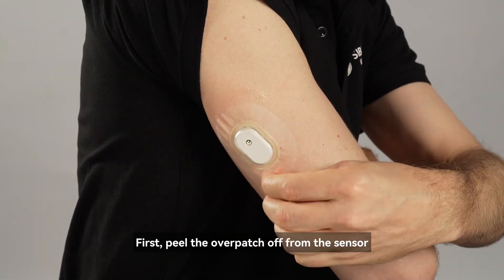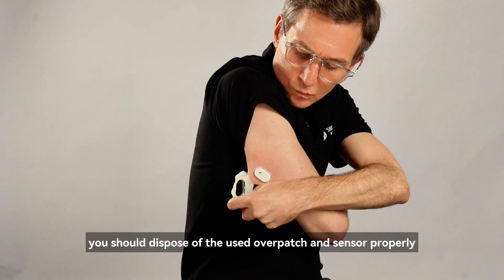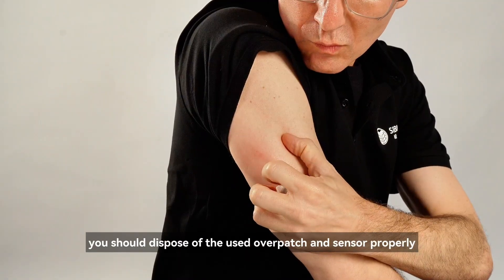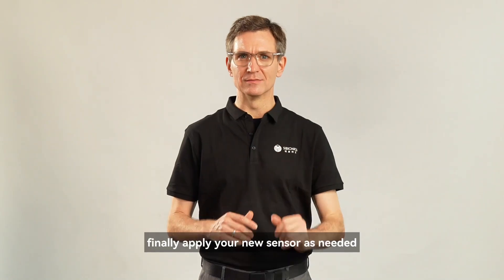First, peel the overpatch off from the sensor, then remove the sensor. You should dispose of the used overpatch and sensor properly. Finally, apply your new sensor as needed. That's it.